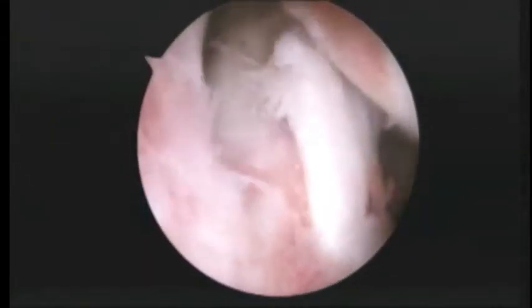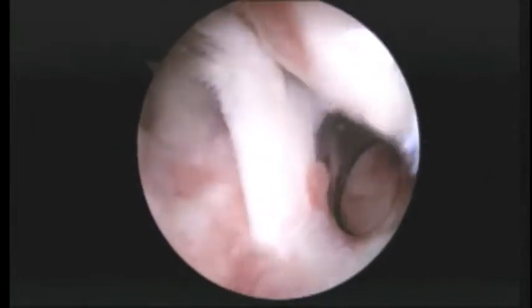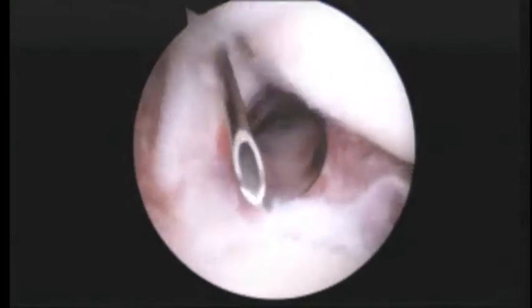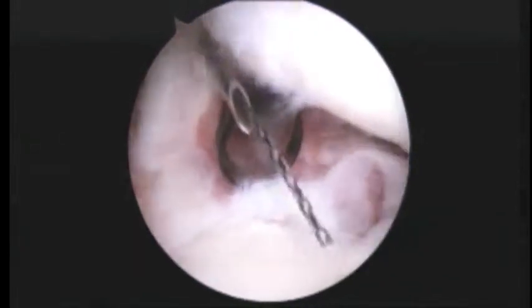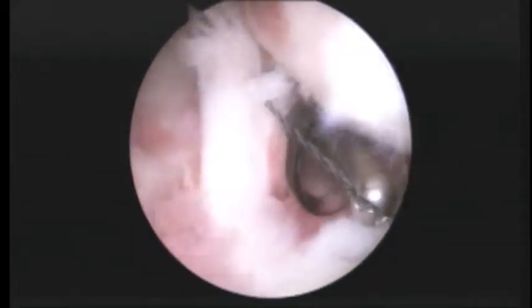So as we look over here, we can first look at the biceps. We can see some tearing in the biceps tendon there. So we're going to go ahead and secure that in just a second by passing a stitch through it. There we are, going through part of it there. Now, through that needle, we're going to pass a black wire called the super shuttle. And then we're going to grab that and use this shuttle to relay a stitch back through the biceps.